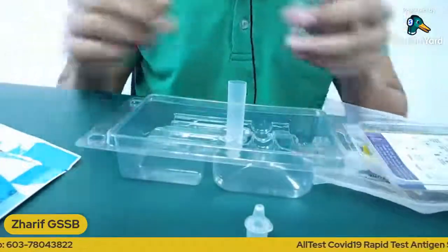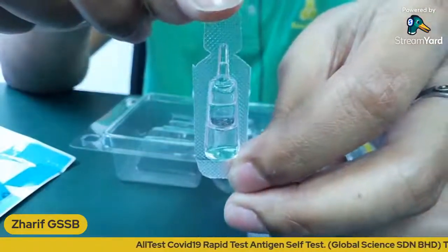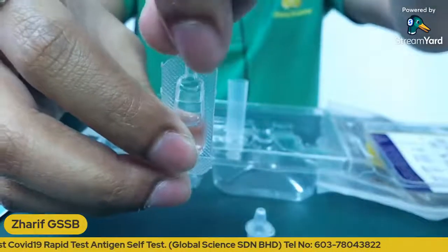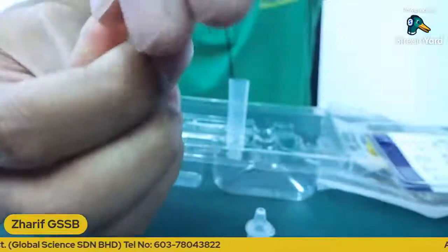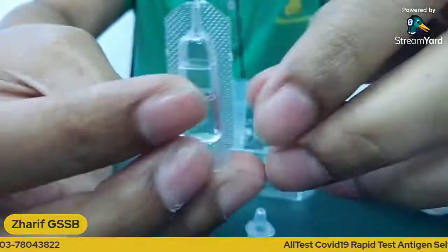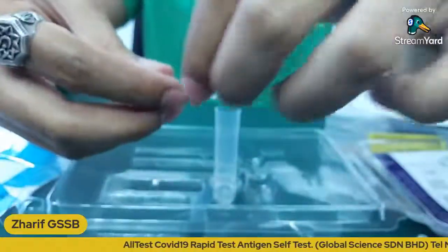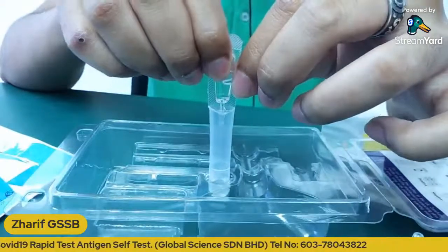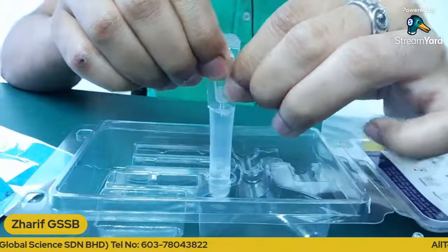The next thing you need to do is apply the buffer. To open the buffer, just hold the tip and twist it open, like so. Then gently apply the buffer, and make sure to squeeze it completely until all of it is inside the tube, like so.